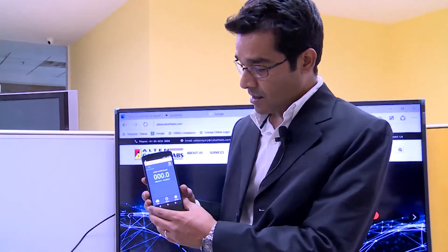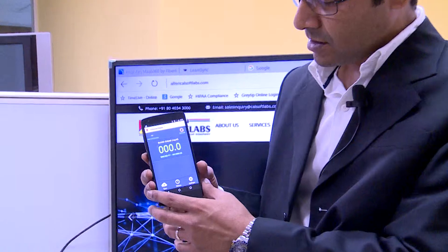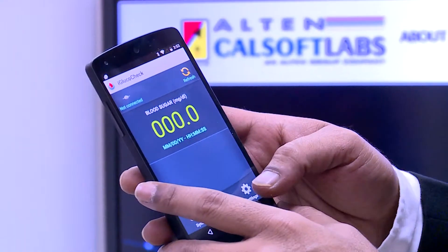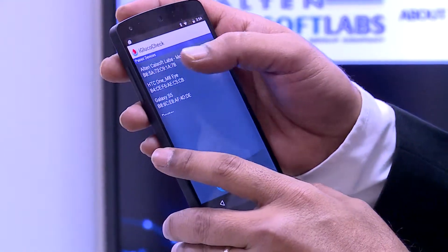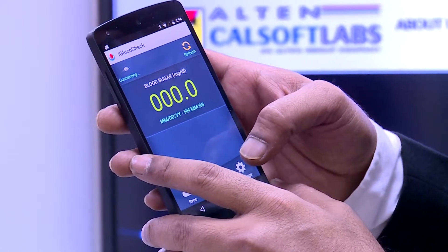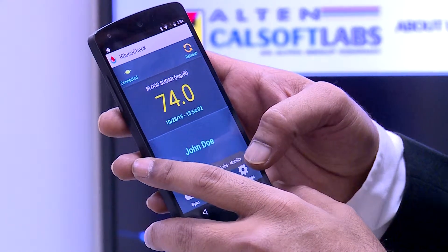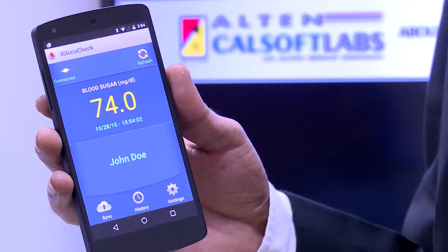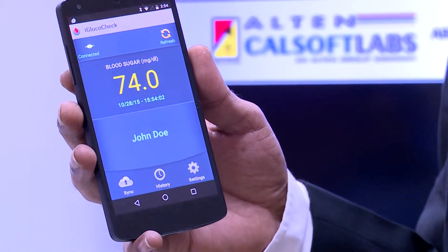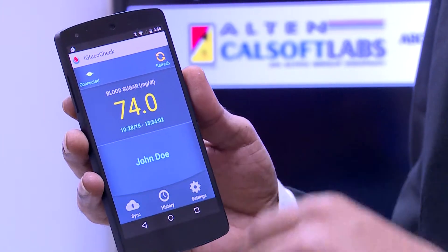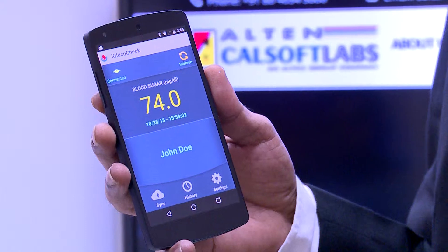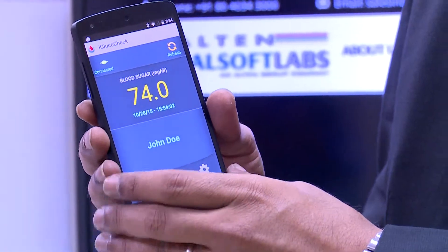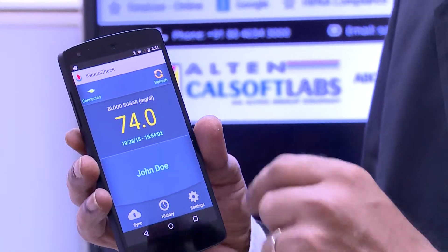So this is the application — it is not currently connected, so I will connect it to the Bluetooth device. Now it is connected. The first time when the application is being set up, you would need to provide certain credentials. You can see my name here, and every reading goes along with the date and the time.